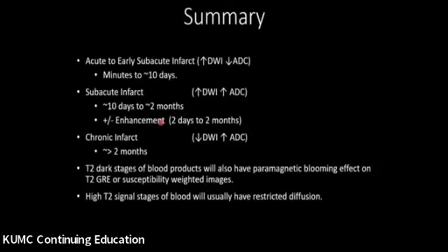And that's kind of the rule. Anything that's T2 bright, protons don't move in, can diffusion restrict, whether it's acute infarct, subacute blood, or T2 bright stages of blood, epidermoid, abscess, etc.